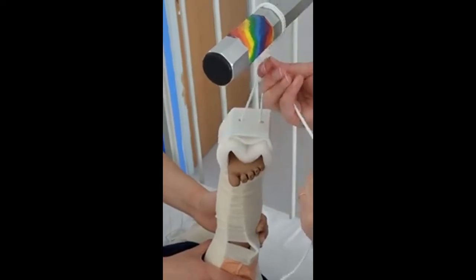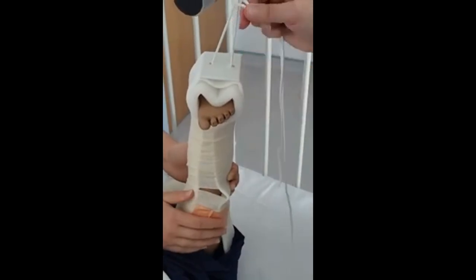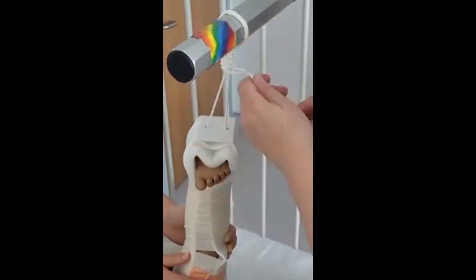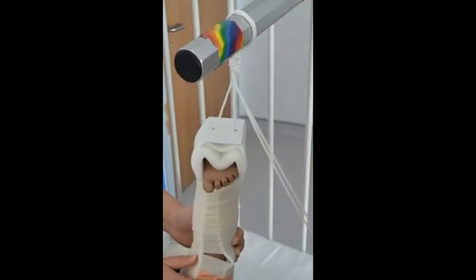You can then trim off the strings with a pair of scissors, and you can put some tape around the knot if you think it's going to be fiddled with by the child. Then you would do the same on the other leg.